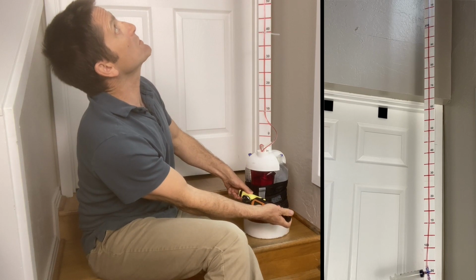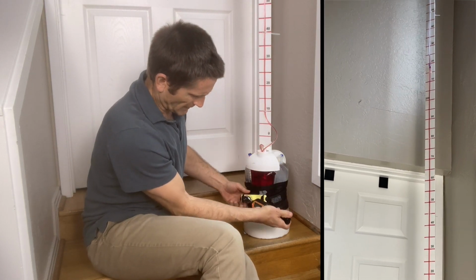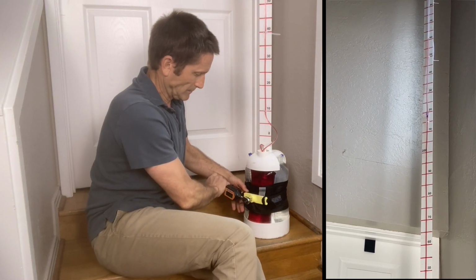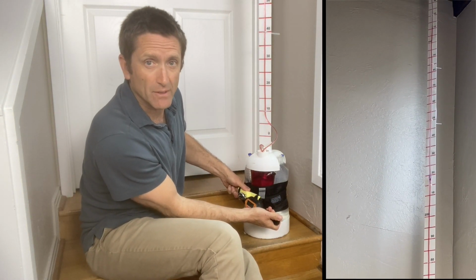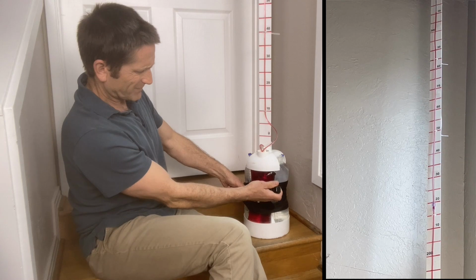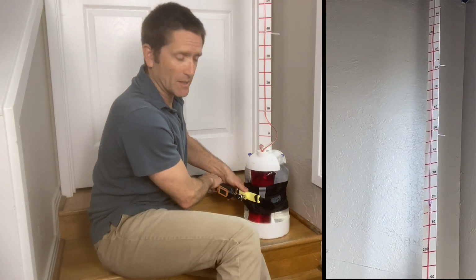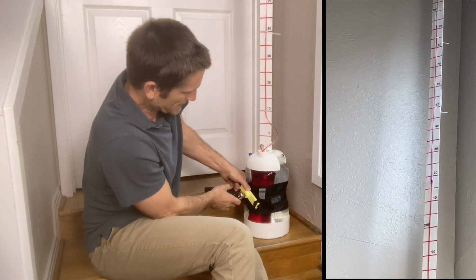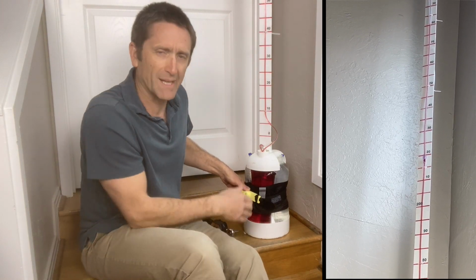2.28 Newton meters brings me up to 205. Let's do it again. 3.38 Newton meters gets me to 260. 4.97 Newton meters brings me to 310. I might be able to get one more twist. No, that's basically the end of the line there. I would not do this to a patient. That's the peak there. It's at a point where it's deforming the tourniquet. So that defines what I consider the high bar mark.